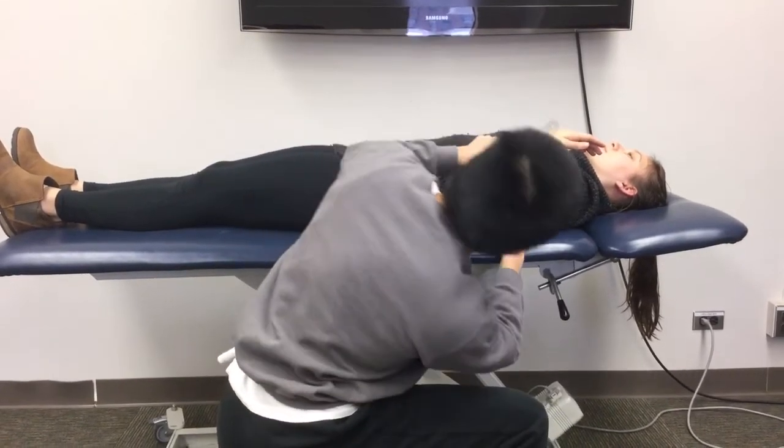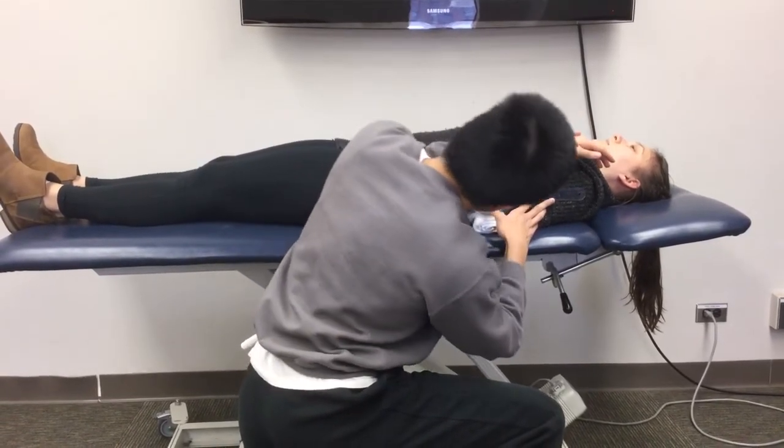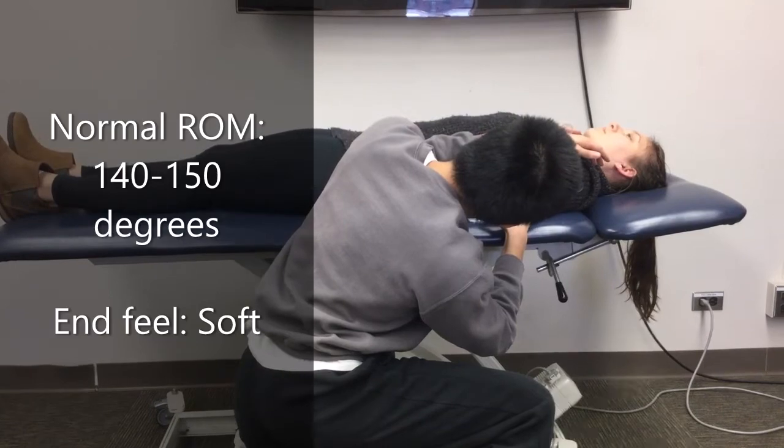Get your measurement, and you can always use some passive motion to try to gain any extra degrees from soft tissue tension. Normal range of motion is 140 to 150 degrees, and there should be a soft end feel.